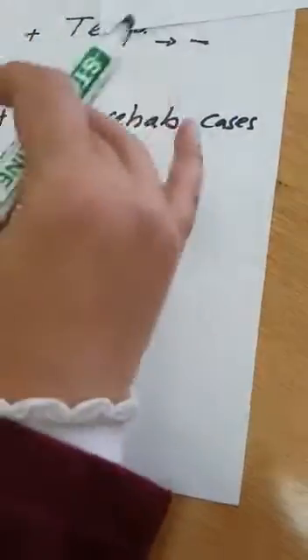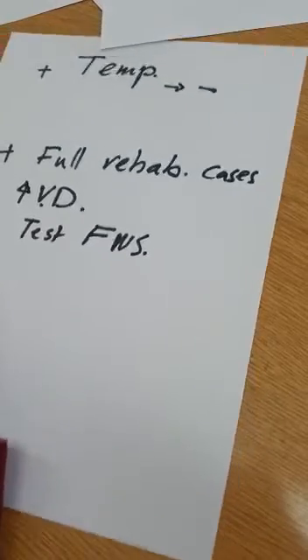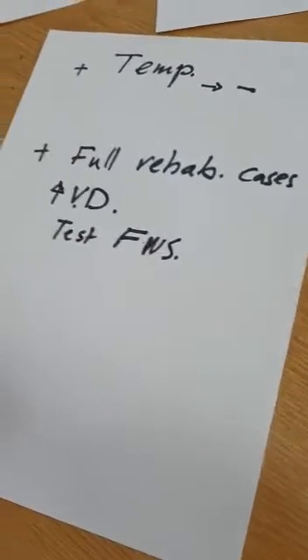And of course, in the temporization composite step, we follow the same mock-up positions that we found suitable in our clinic. Okay, so those are about temporization. If there is anything else that you need, just let me know.